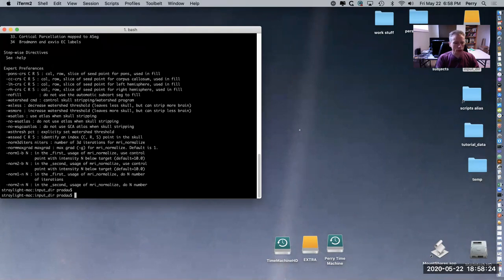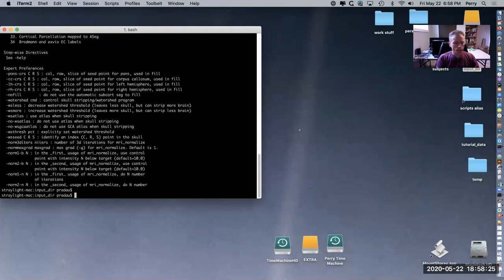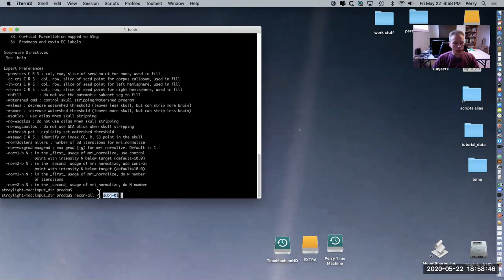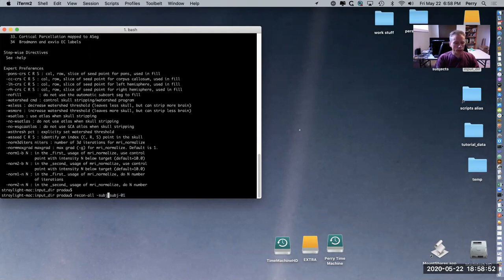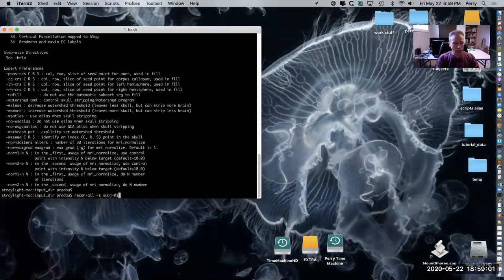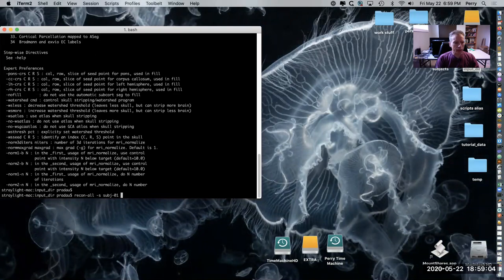We would go recon-all dash s and we would name this subject - this is the identifier. The dash s flag is telling you what identifier I'm using for the data, and in this case I'm calling it subject one. One thing to note is that there is more than one way to specify this flag, but I would suggest that you just use dash s - it's simpler and I think you'll find that that's easier to remember.